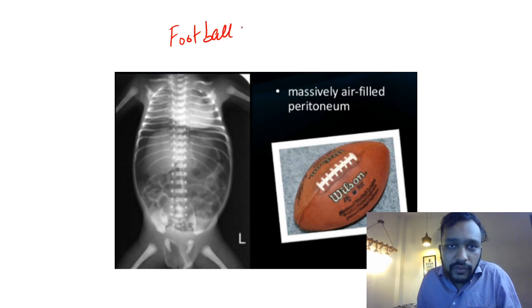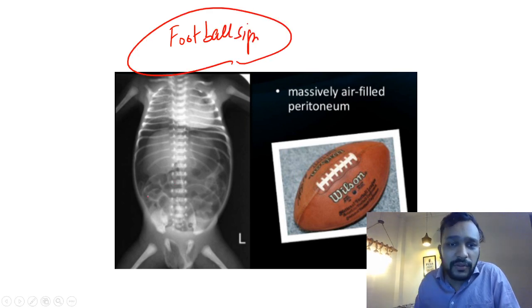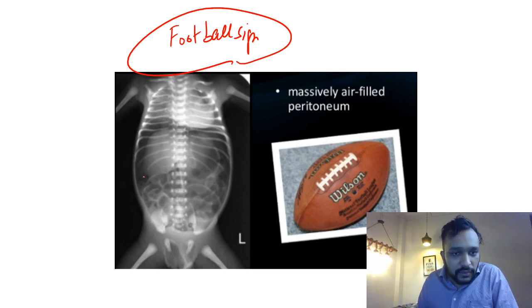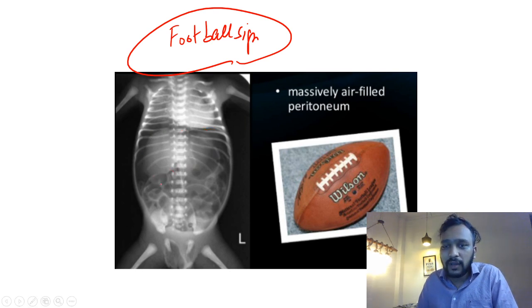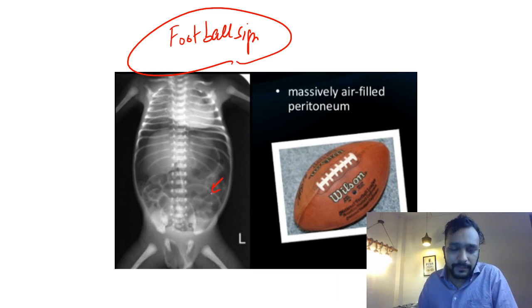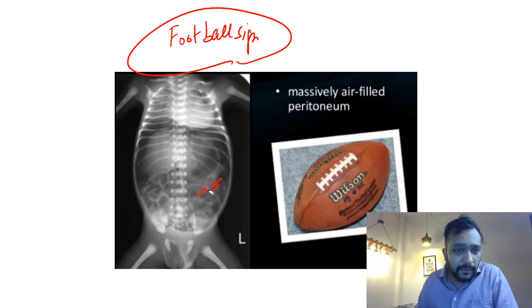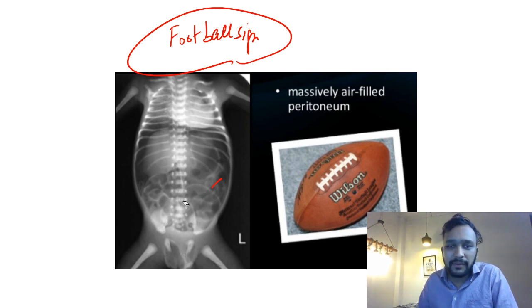In this case, collection of air in the peritoneal cavity gives one sign known as the football sign — excessive distension of the peritoneal cavity. Also, looking at this X-ray, you can see the margins of the liver. Liver margins are usually not appreciated on an abdominal X-ray, but in this case they can be appreciated. This is the liver edge sign. You can also see the bowel wall, which normally cannot be seen on an abdominal X-ray.